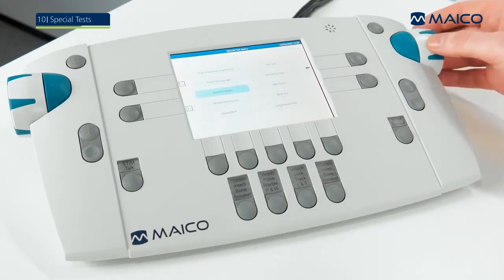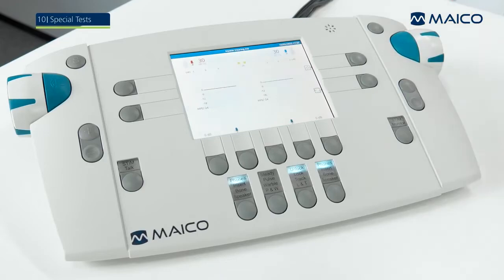The master hearing aid allows the adjustment of different frequency slopes for speech signals to demonstrate the benefit of a hearing aid.